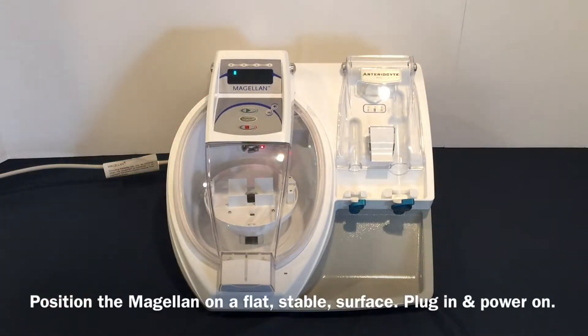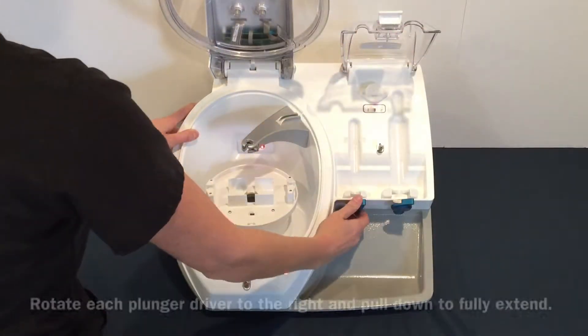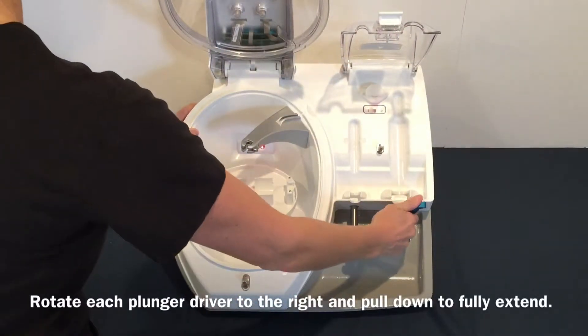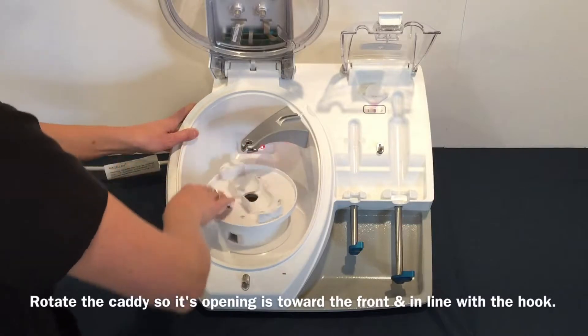Position the Magellan on a flat, stable surface, plug it in, and power it on. Open doors 1 and 2. Rotate each plunger driver to the right and pull down to fully extend. Rotate the caddy so its opening is toward the front and inline with the hook.